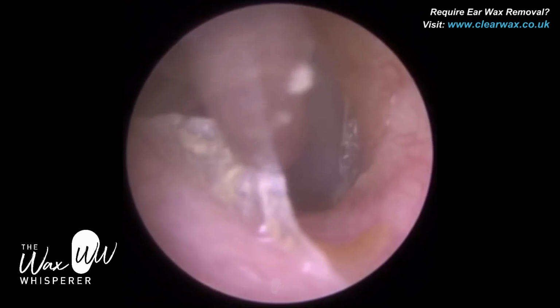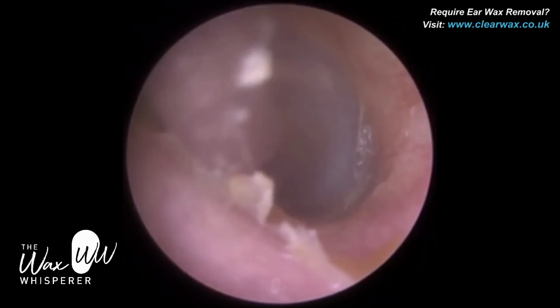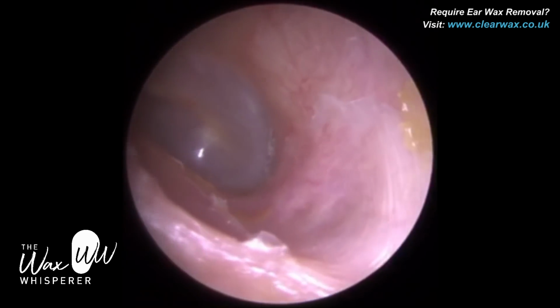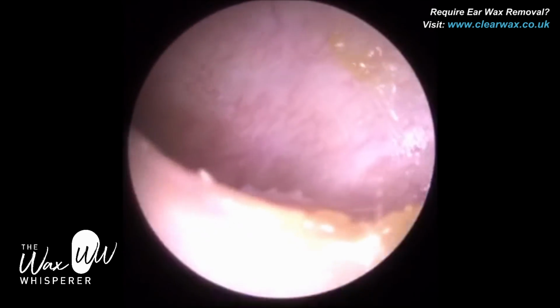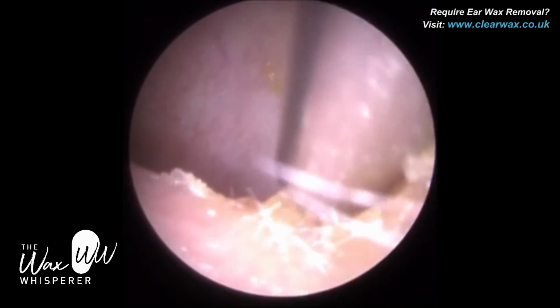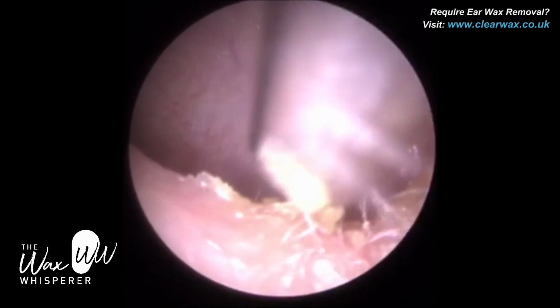When you peel keratin, it can also clarinet. Clarinet is a high frequency whistling noise that occurs because this keratin flaps violently at the tip of the suction probe. A fine end is great though, it really reduces that clarineting, and this patient fortunately didn't get any clarineting. It's just some soft mushy keratin just at the entrance here, just at the base.